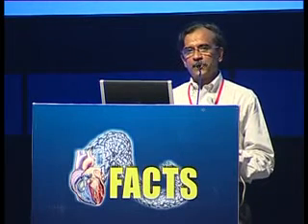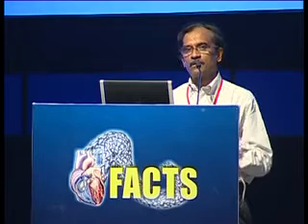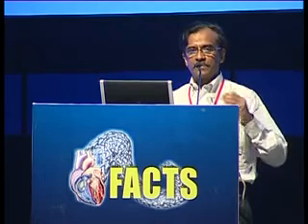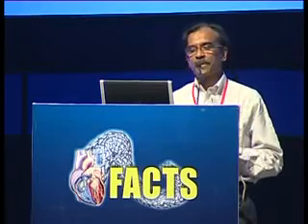And another issue is that it's not uncommon to have entrapment of the catheter by the atrial septum, especially when you are using a recycled balloon catheter which loses its coating, and this causes a lot of friction at the atrial septum. So if the catheter is entrapped by the septum, however much you push, it is going to form a loop in the right atrium, and sometimes it may prolapse into the right atrium, and then you may lose access to the left atrium.